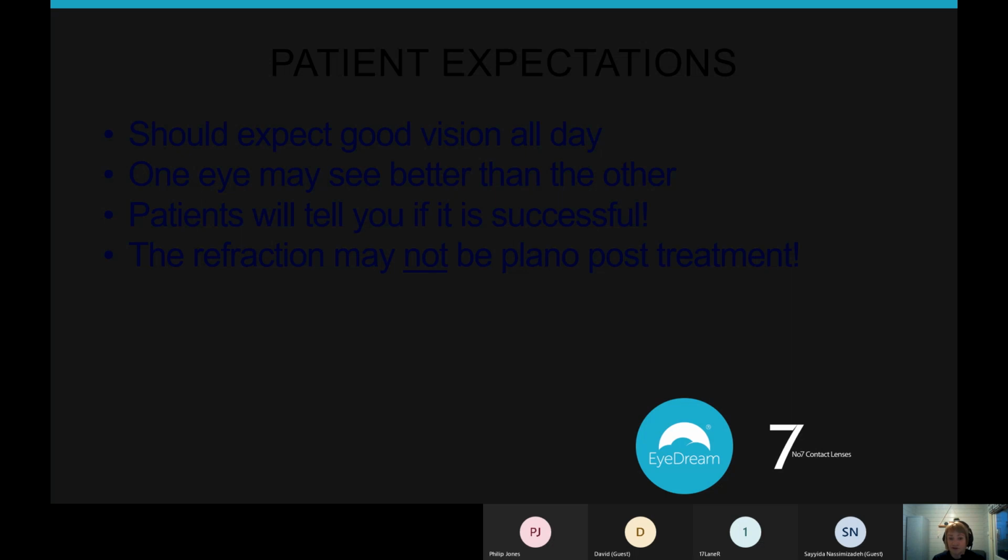And then I would send off the topography, and I would either be told that there wasn't any improvement that could be made with another lens, or another lens would come and it wouldn't improve it. And I'd kind of knocked that patient's idea that it was successful. So therefore, I think go with your patient's idea of success. And if they're happy and you're happy with the level of vision that they're getting for things like driving, etc., then I think you can leave well alone.